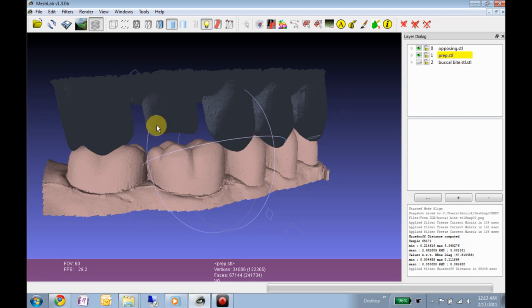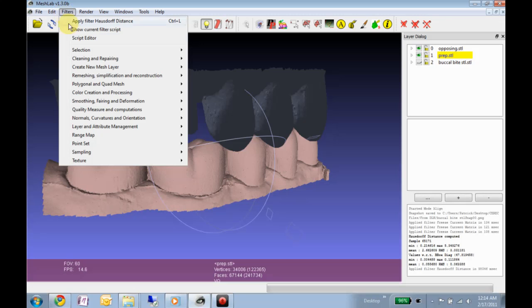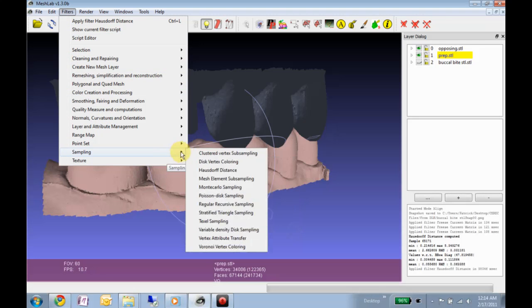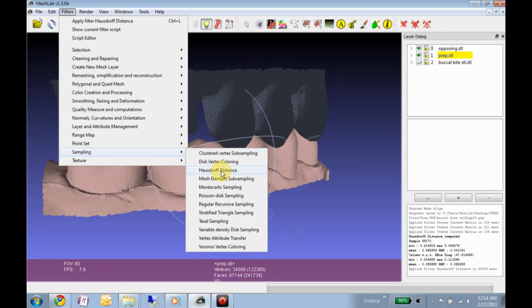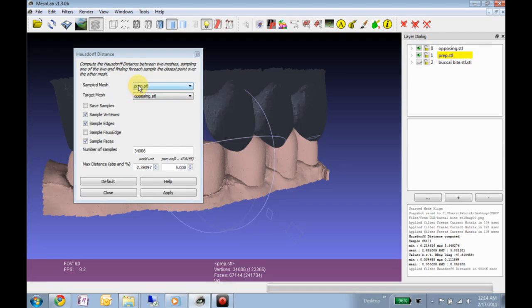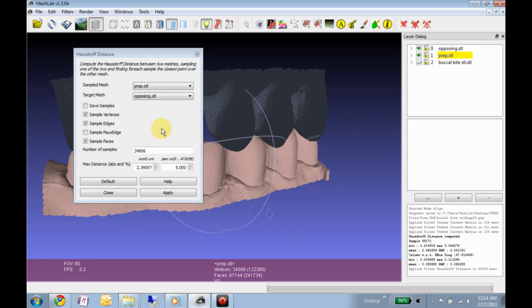So what I've already done, because my computer can't handle screencasting and running the calculation if you're following along at home, is I did this algorithm right here which compares a sample of points on this mesh to a sample of points on this mesh, and then calculates the distance between them.